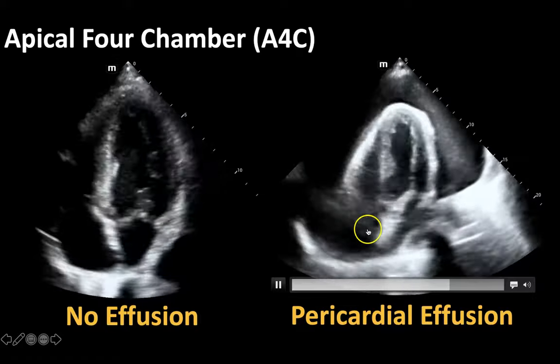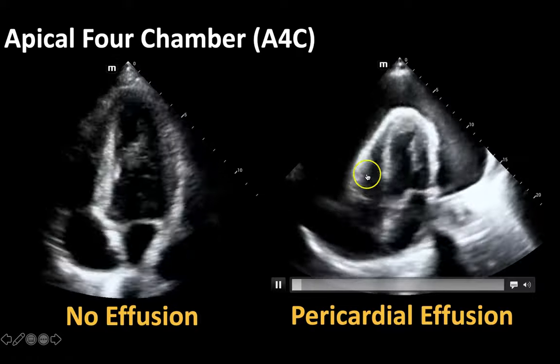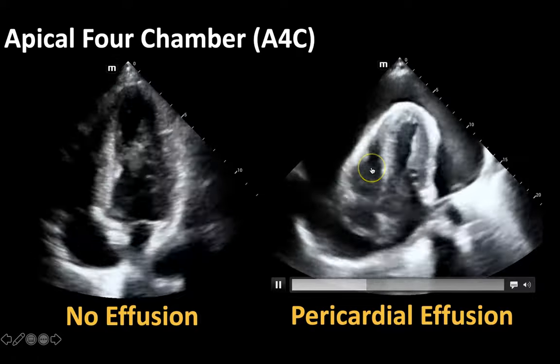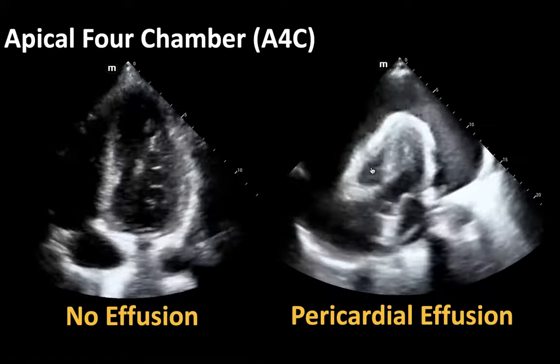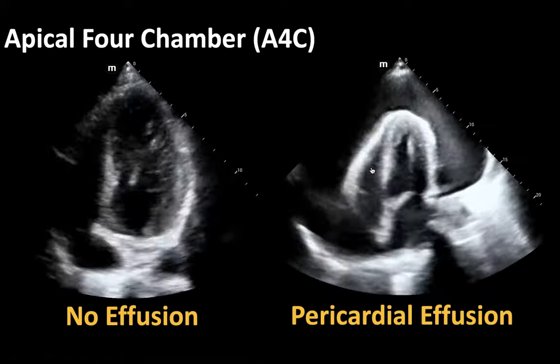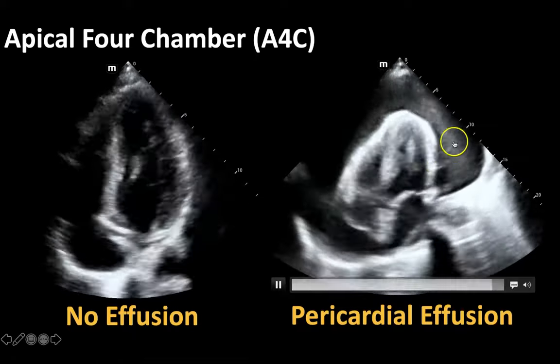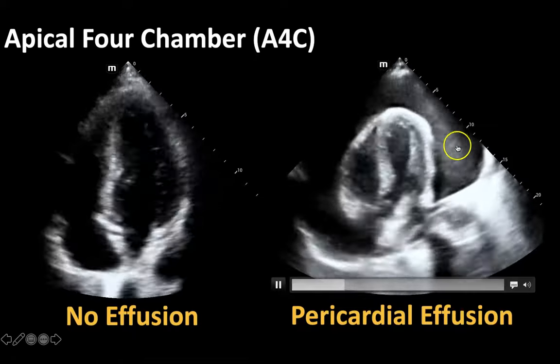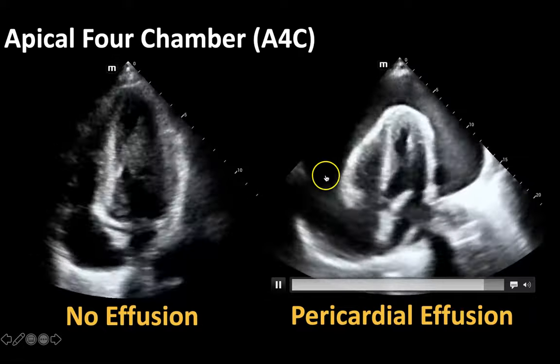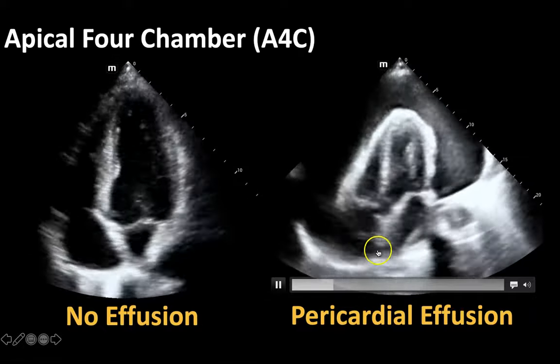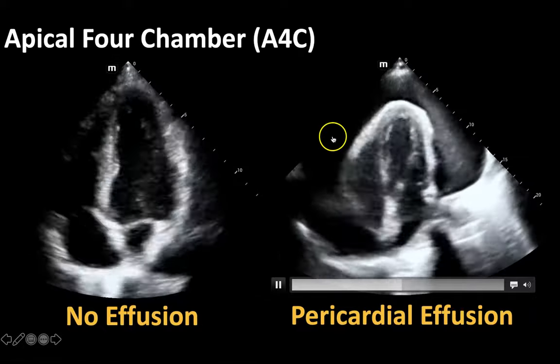Your left atrium, your left ventricle, your right atrium, and your right ventricle. But you'll notice that this scan looks a lot different from the one on the left side of the screen because now we can appreciate this large pericardial effusion all the way around the heart circumferentially.